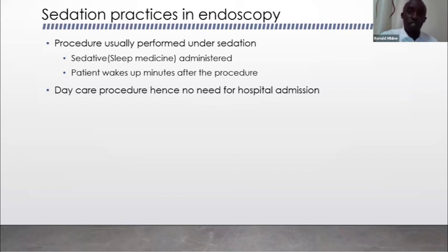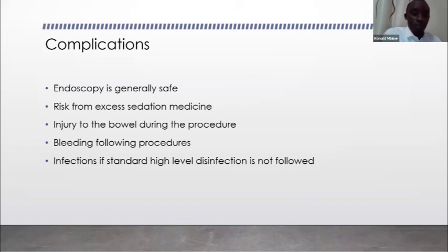and you can walk out of the endoscopy room. Of course, we don't advise that you drive or operate any machinery after the sedative medicine, but at least you should be able to be fully conscious. And immediately after that, you can take your meals, you can eat your food comfortably. Endoscopy is not an in-hospital procedure, so it means you get to the place, have it, go back home, without having to be admitted.